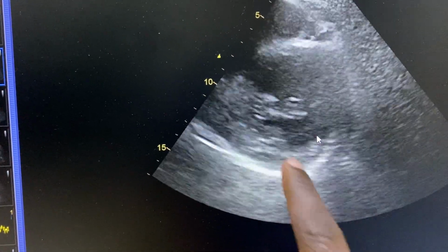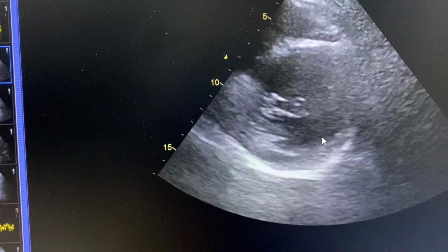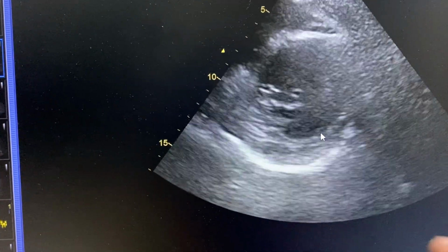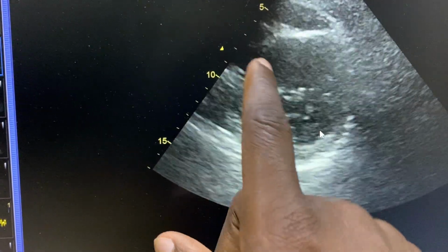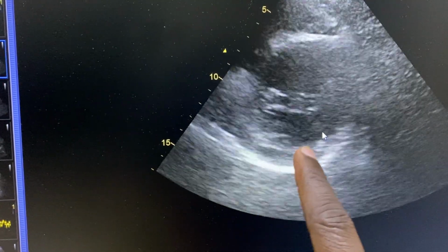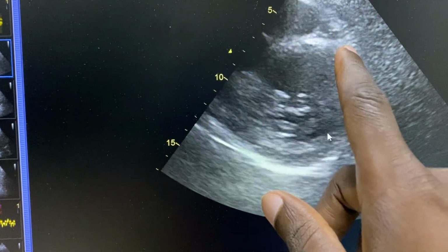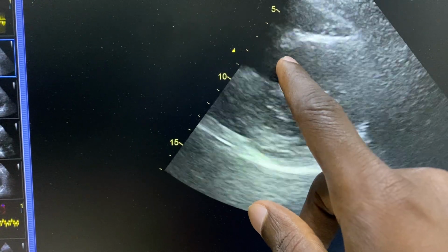So when you see clearly this side, you see the endocardium. Now to check for wall motion abnormalities, we have to see the endocardial excursion. In systole and diastole, don't look at the entire wall, you just see the endocardium where it is going. In systole, it should move inside; in diastole, it goes out. So if you see here, from around here, it is moving very well, and here, moving very well. So this segment is moving, but from here up to this side, it is not moving. Here it is not moving, here it is just hypokinetic.